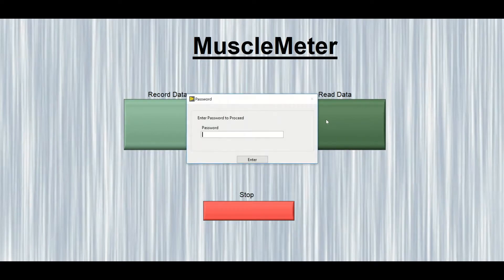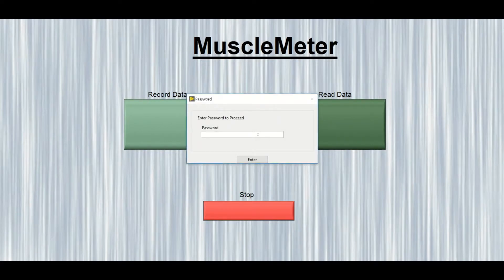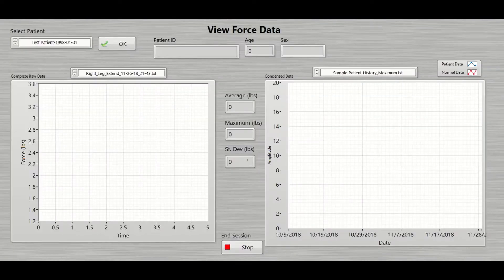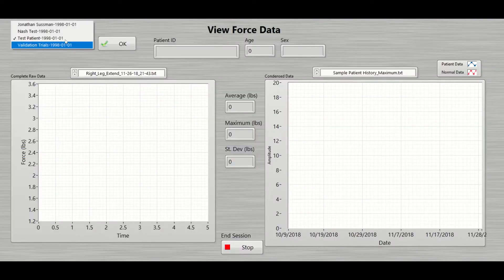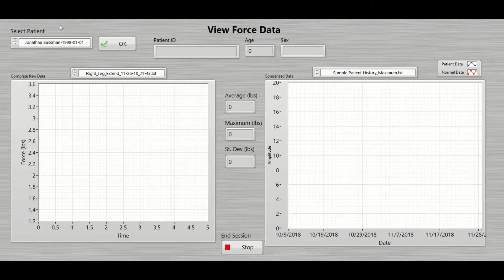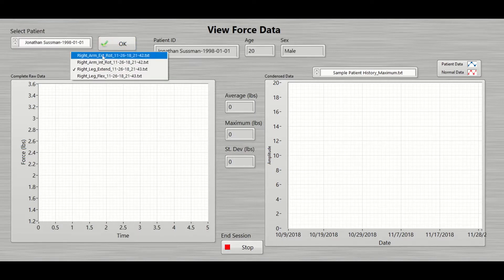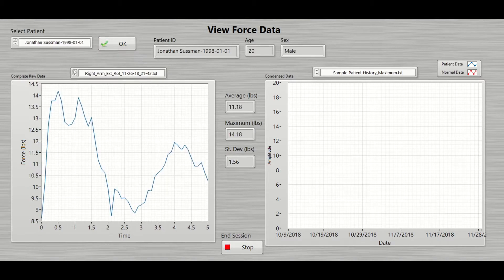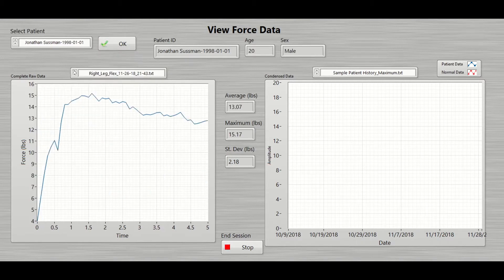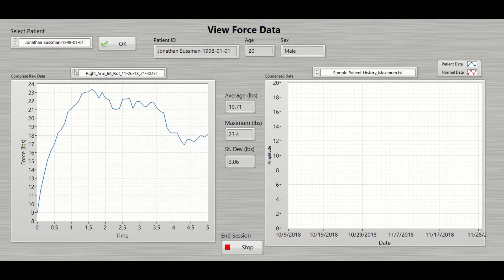To view the data, the user can launch the data display application from the main launcher. A password is required to enter the application. From this application, the user can select the patient. The user can view the complete set of raw data on the left panel. Each test shows the name, date, and time it was conducted. The plot on the left shows the force measurements over time.